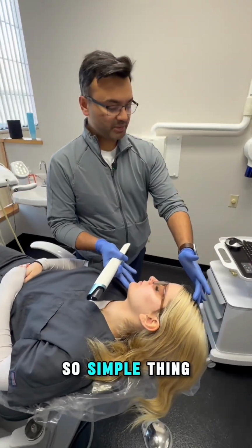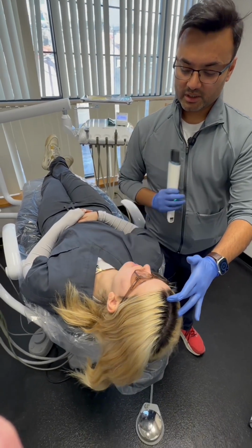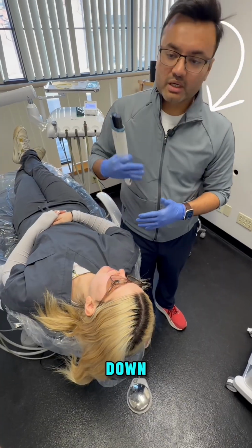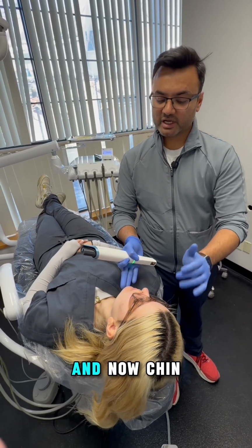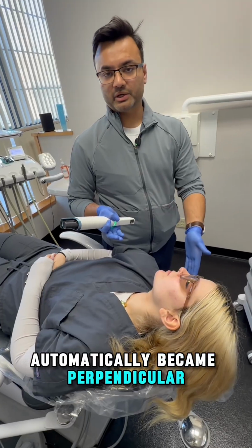So, simple thing. Let's look at it this way. I told the patient, turn towards me. They will immediately look down. So, they are turning but looking down. Don't overlook these little things. They play a role. So, turn towards me and now chin up to the sky. See how the maxilla automatically became perpendicular to the floor.